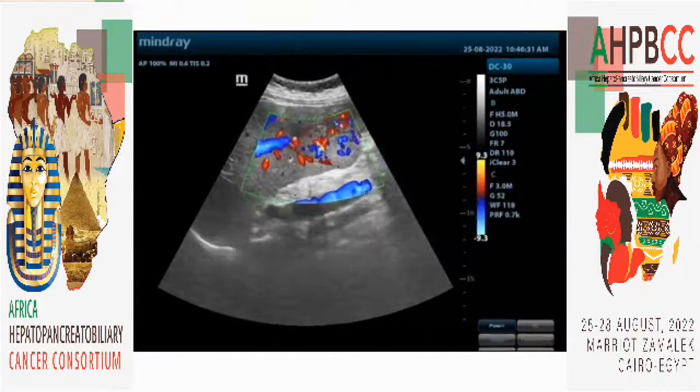Because of the time, I think we reached that this patient has a non-cirrhotic liver, a single big lobulated hypervascular focal lesion. So we have to put some differential diagnosis according to our ultrasound examination, and then we have to call for a second opinion from the imaging.